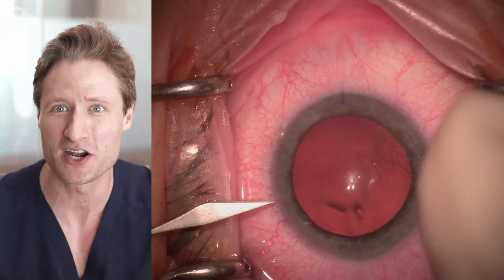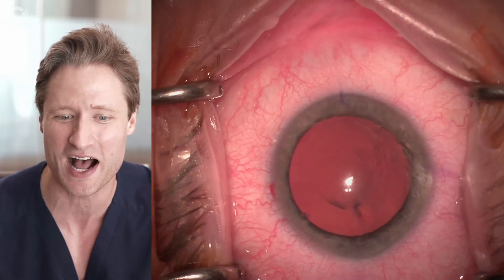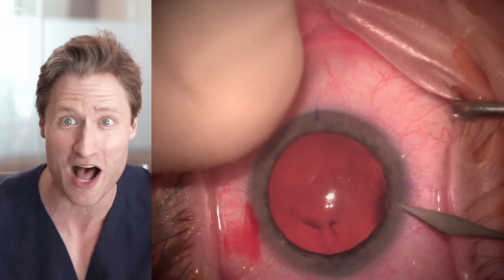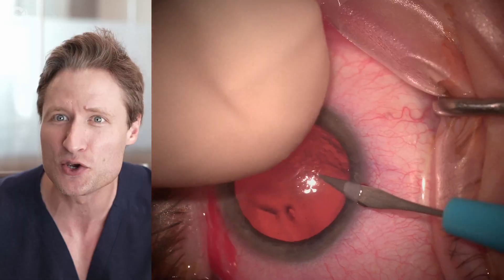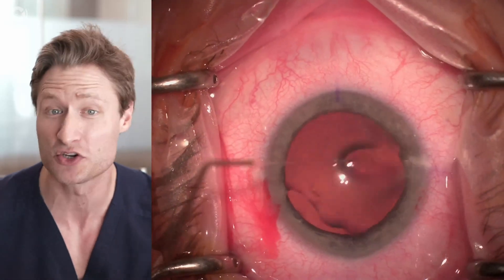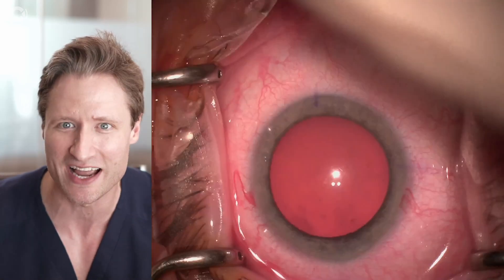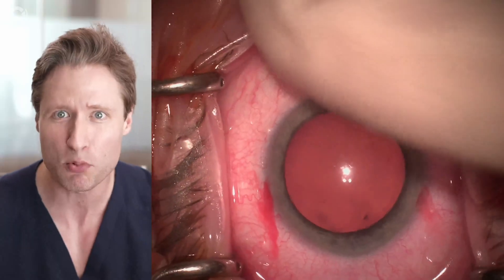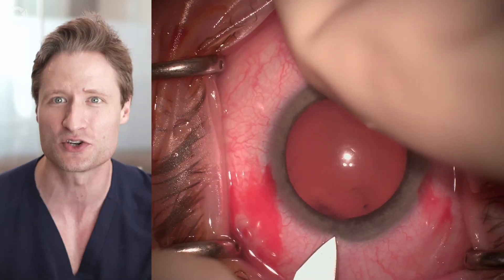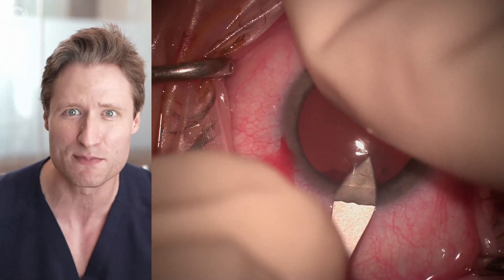This is a patient we operated on just five days ago. She is receiving an ICL for high myopia, done under topical anesthesia in our normal operating environment. I begin by making two paracenteses superiorly and inferiorly, then place a little preservative-free lidocaine inside the anterior chamber, testing the patient's response to these manipulations before making the main wound.